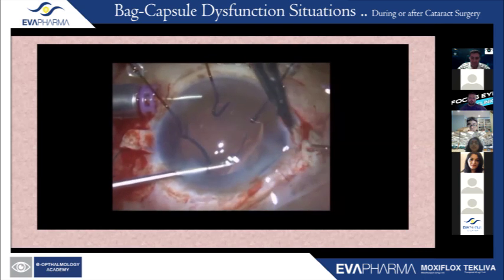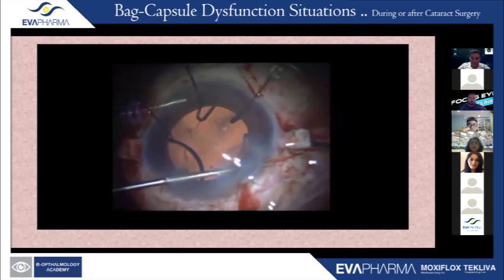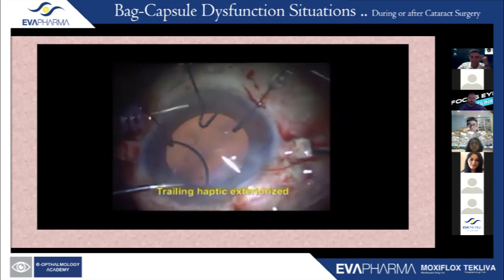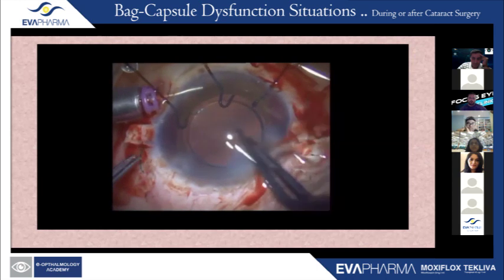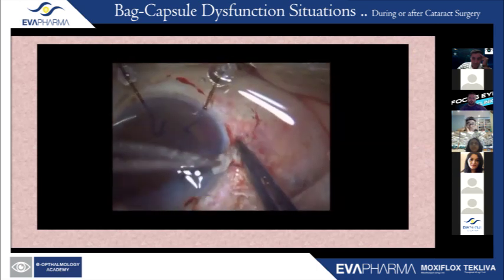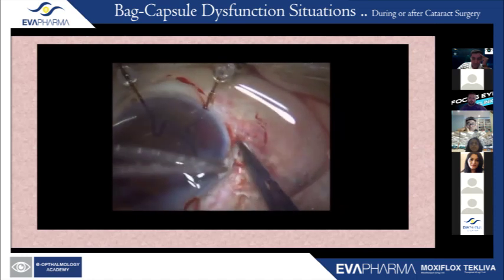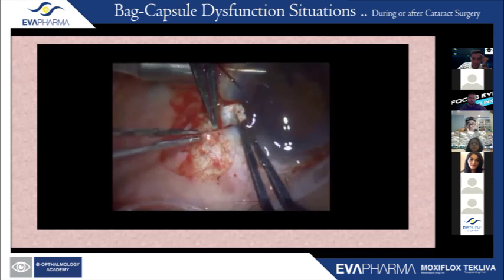Again, you can see that I insufflated that space between the iris and the anterior capsule with viscoelastic. Again, externalize the trailing haptic using the handshake technique. Once that's done, you've got this IOL sitting very stable on top of a capsular bag. And in addition, you've got those haptics stuck into the intrascleral Scharioth tunnels, and that gives it the long-term stability that the glued intraocular lens gives.